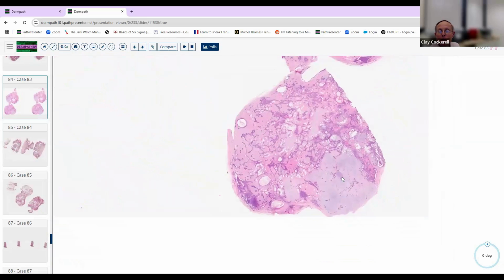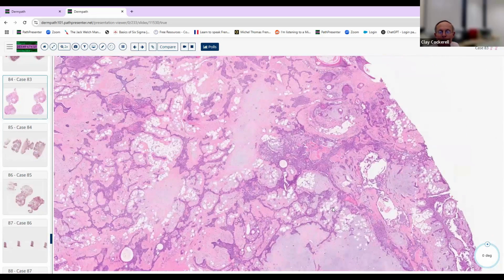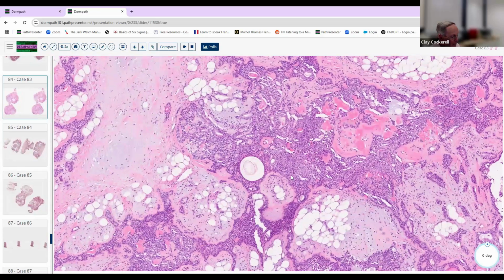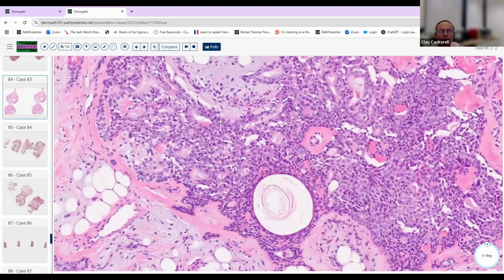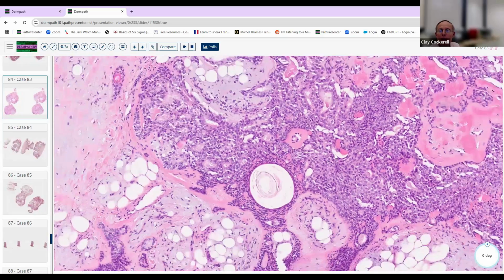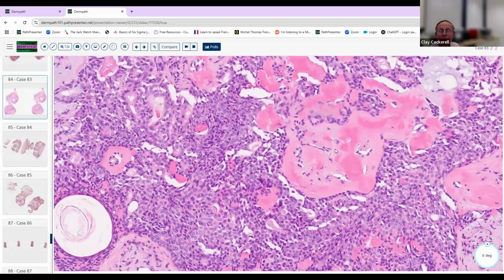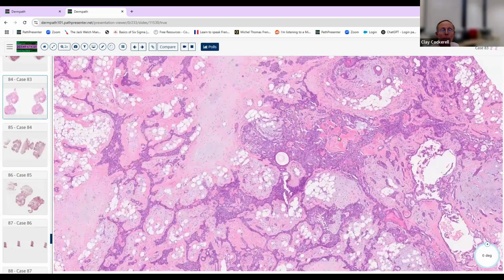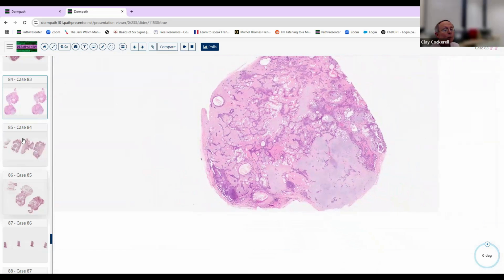Tumor with a lot of mucin and cartilaginous differentiation coupled with areas of ecrine differentiation. Chondroid syringoma. This is what's called the syringomatous component. Here you see chondroid. Here you see some osteoid that's formed in here. So this is cartilaginous metaplasia, chondroid syringoma. Another pretty straightforward one.